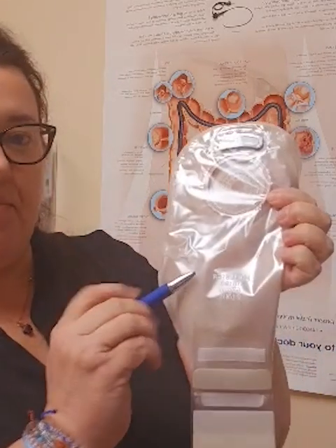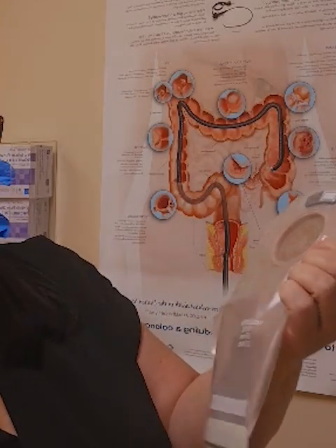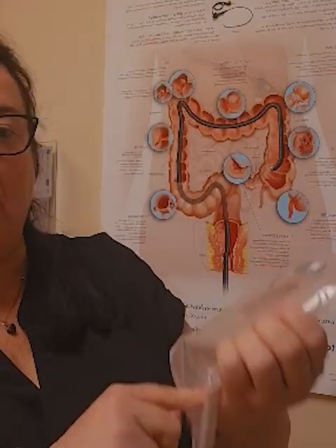If you are getting your supplies from a durable medical equipment facility, then what you would do is tell your provider, either your primary care provider or your surgeon's office, what supplies you need. You would need to give that office the type of what it is. So like this, for example, is a Hollister bag, and there's a reference number that comes with that bag, and you would give that office that reference number.